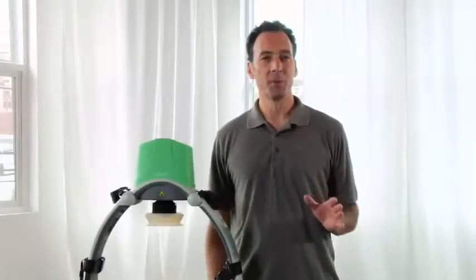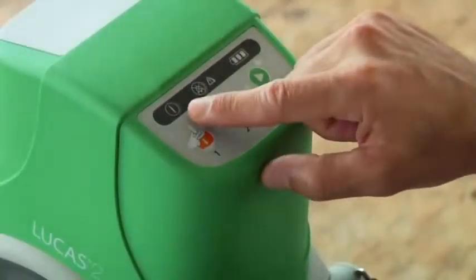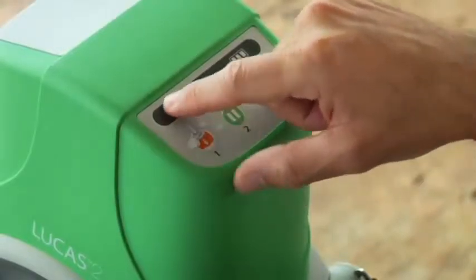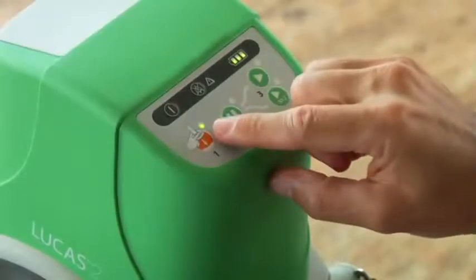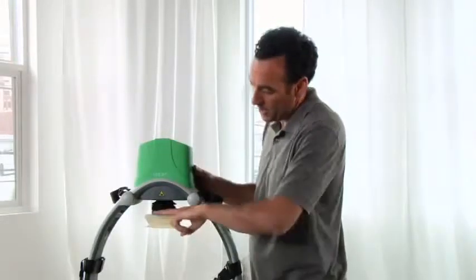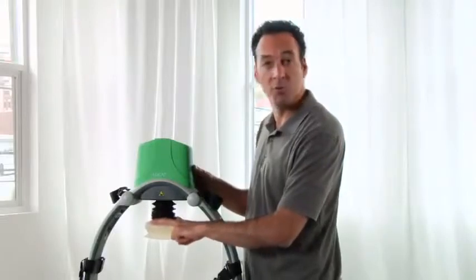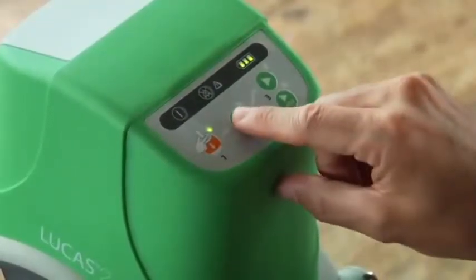Lucas is very simple. This is the control panel. Here's the on-off button — push it down for one full second to power on or off. When the green LED next to the adjust button lights up, you can adjust the suction cup to the correct start position for each patient. Use the pause button to set the start position for the suction cup.